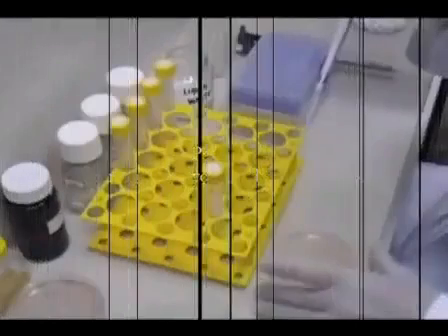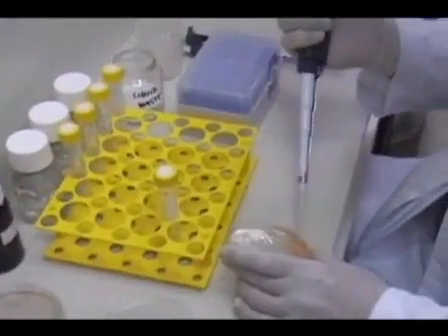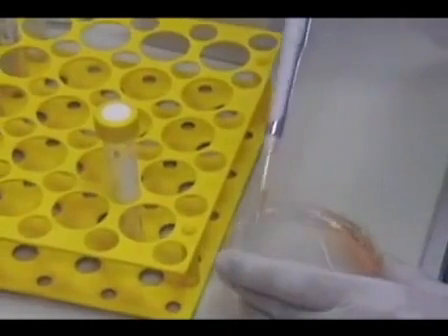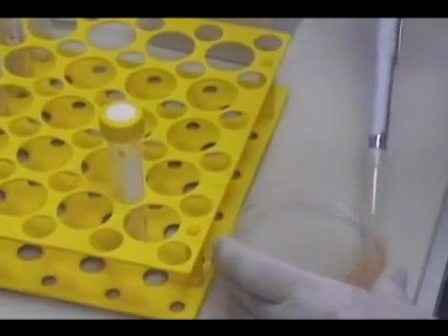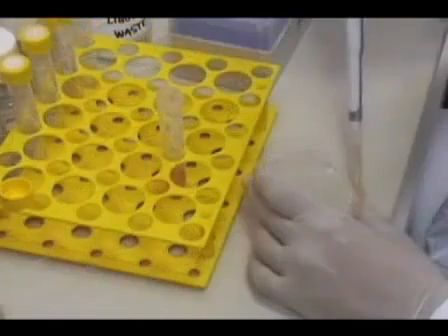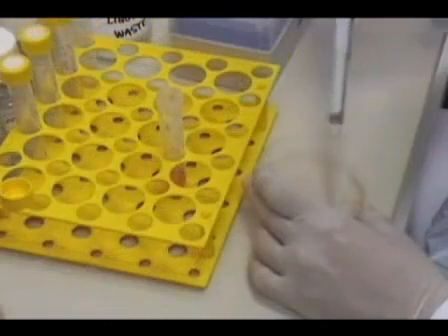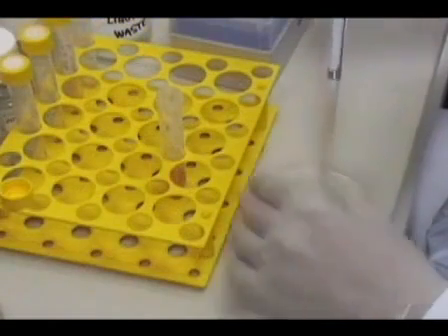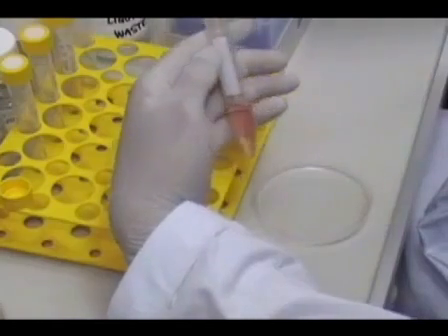Part 3. Here, the human embryoid bodies are being cultured in non-adherent culture plates. Using a pipette, we group all the embryoid bodies as close together as possible in order to transfer them to a 15 milliliter conical tube. The EBs are carefully harvested and transferred to the tube. It is important to collect all EBs since there isn't a large amount of material.